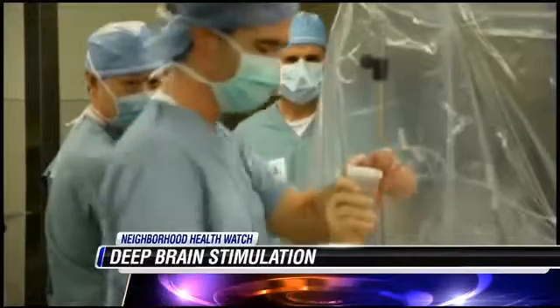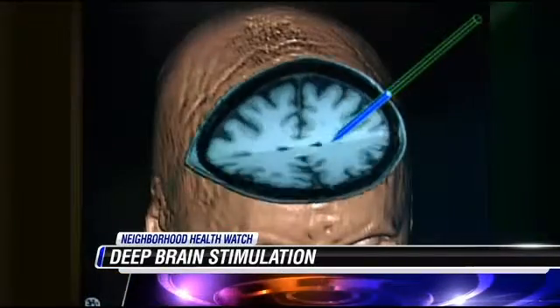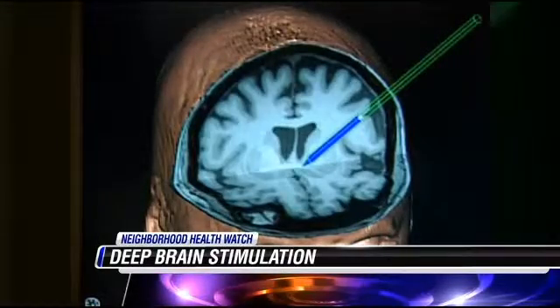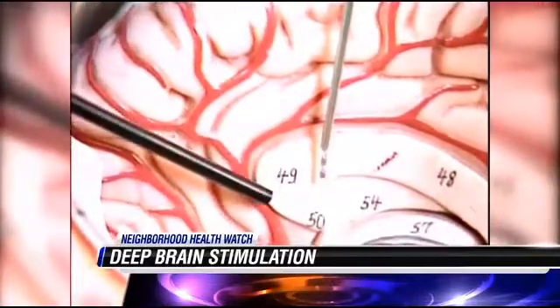Okay. Now, what is asleep DBS? Okay, so traditionally we have a long-standing program at Johnston Willis where we've been performing the procedure, but now we're able to perform the procedure with the patient asleep. Traditionally, the electrode is placed in a part of the brain. To verify that the electrode's in the right spot, we would normally test the device in the operating room, and the patient would be awake for that. Now what we're able to do is take a picture of the brain with an intraoperative MRI scanner that allows us to verify that the electrode is in the right place.